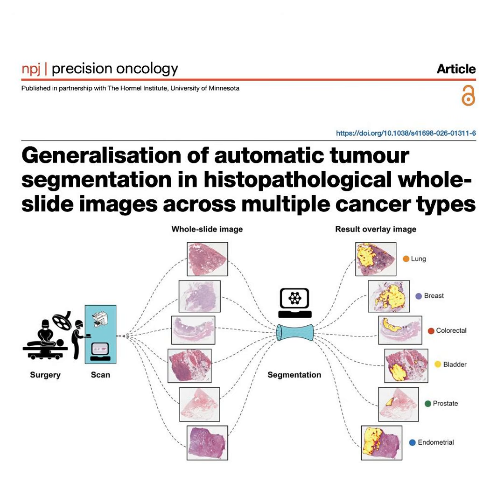It did. But we really have to talk about the bladder anomaly. Yes, the failure. Because while it triumphed in breast tissue, it spectacularly stumbled on a dataset called VUR1. And what kind of cancer was that? That consisted of urothelial carcinoma of the bladder. The DSC accuracy score plummeted to around 50%. Ouch. Even worse, in 33% of those specific scans, the AI found absolutely 0 tumors. It literally looked at cancerous tissue and essentially said, nothing to see here.